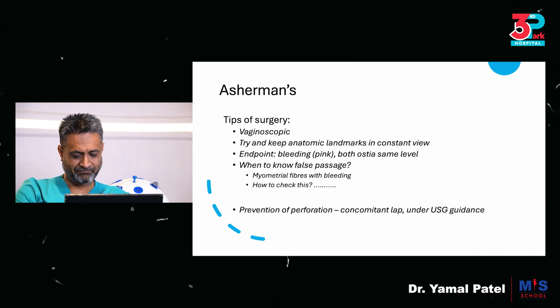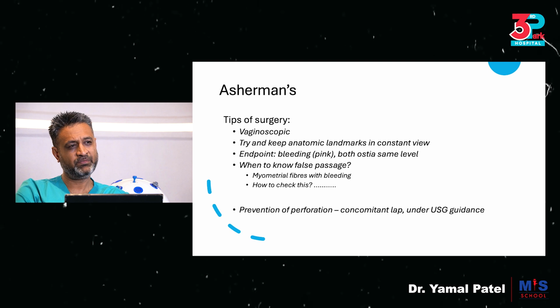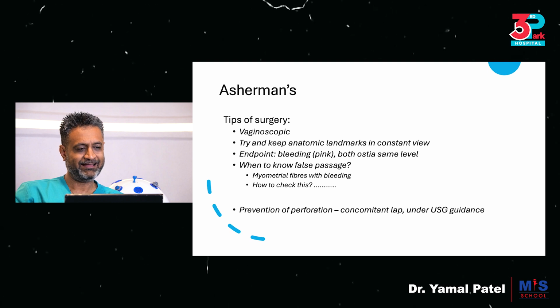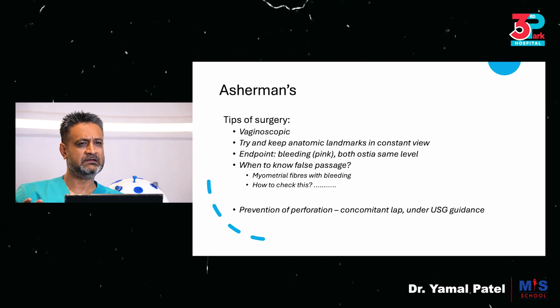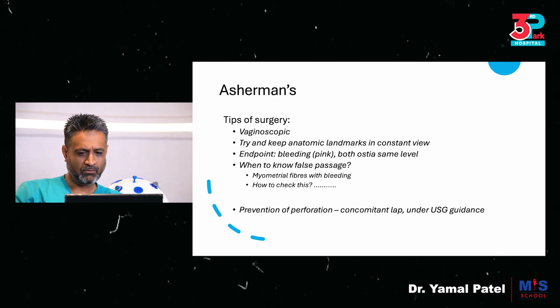So in the discussion on anatomy of a hysteroscopy, we have covered the major landmarks that you should be keeping in watch whenever doing a hysteroscopy. And I think that's important to guide you through this procedure. What is the end point? When do you stop resecting or cutting or shaving or whatever?